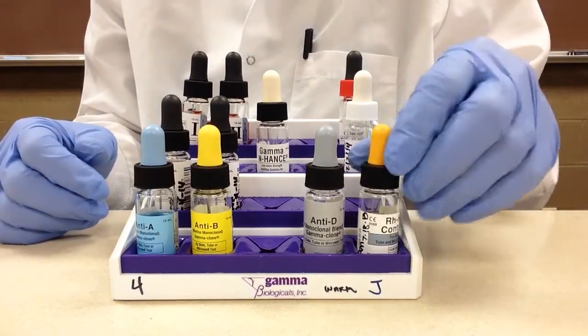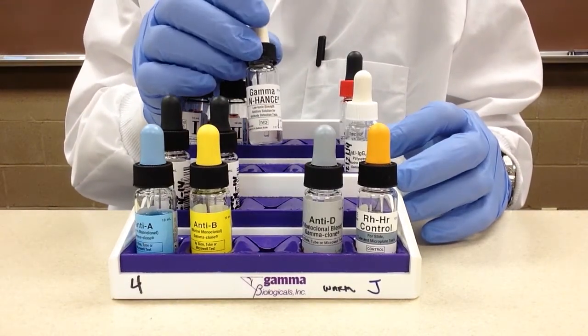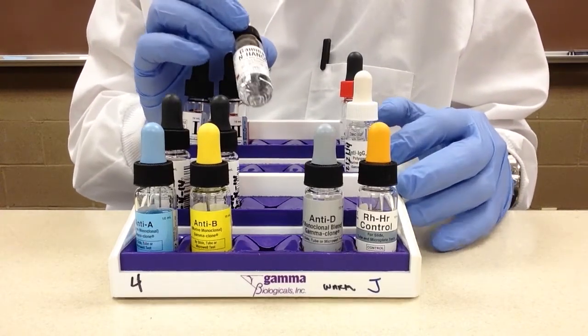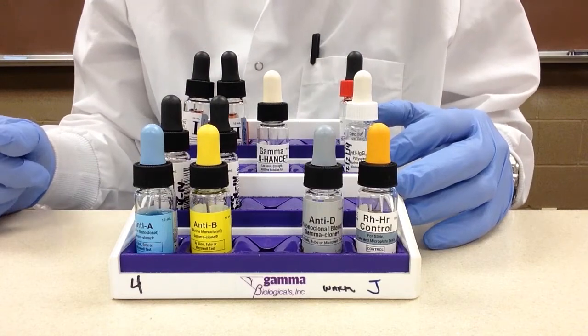Behind that we have what's called gamma enhance, which you probably know more commonly as LISS. This is a potentiator, not to be confused with PEG — polyethylene glycol. They serve a similar function but they have different features.